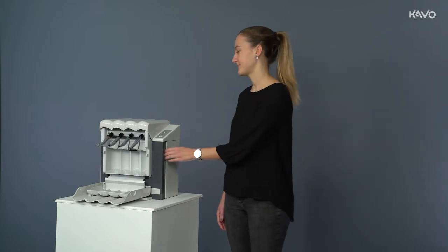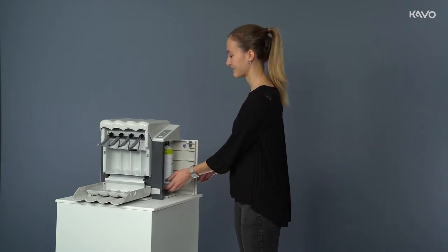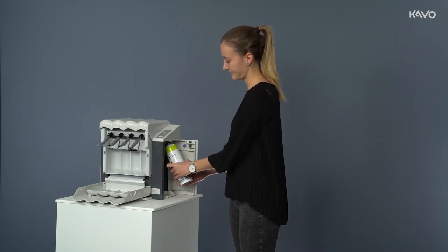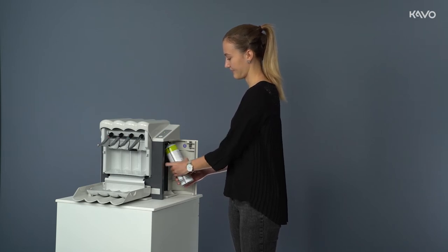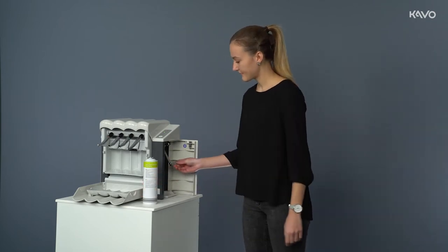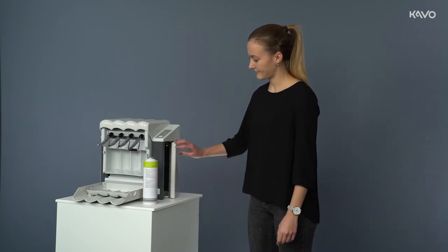The QuattroCare Plus spray was developed exclusively for QuattroCare. The CAVO QuattroCare Plus care spray has a foaming agent which ensures that any residues inside the instruments are dissolved and pushed out with compressed air. This clears the inner tubings, which in turn creates the perfect conditions for optimal lubrication.